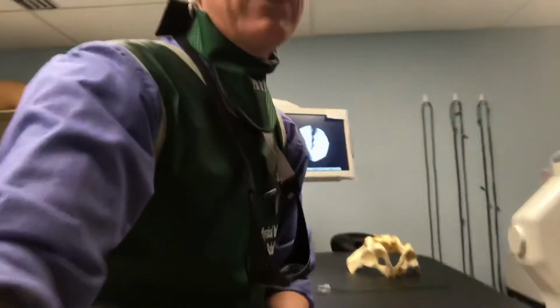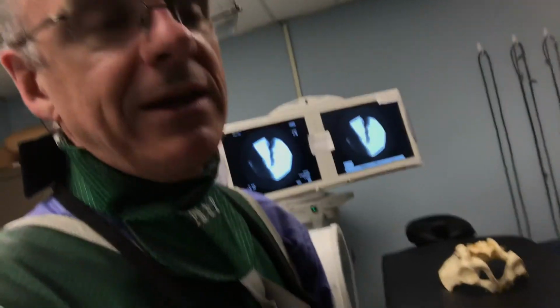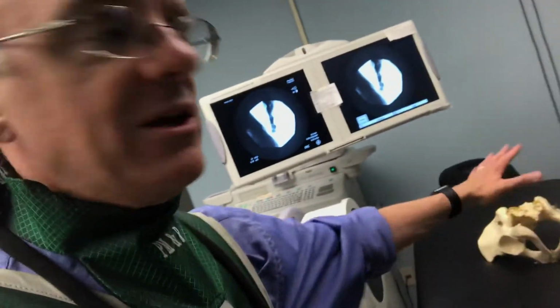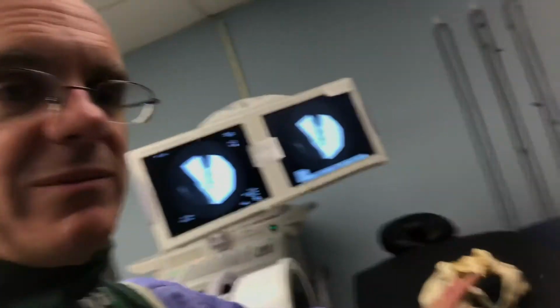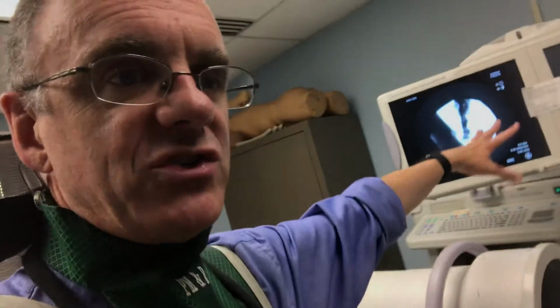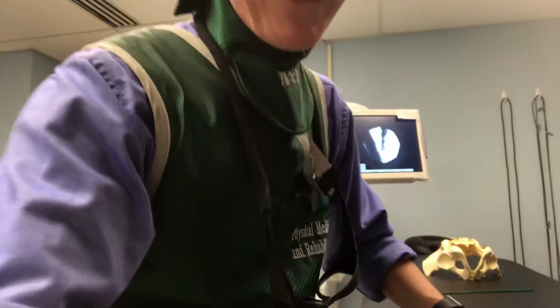So this just shows you the general setup for an injection. The patient comes in. We would of course have a fresh sheet and all of that on the table. We position them like this. We get the image nicely up on the computer screen, as shown on the two screens here, and do the injection in that way. So that's just a little bit about fluoroscopic guidance when it comes to performing coccyx injections.